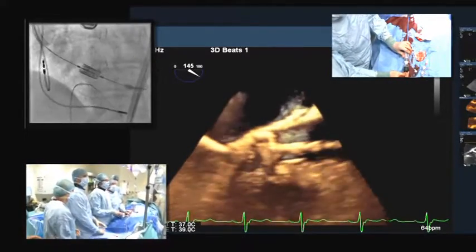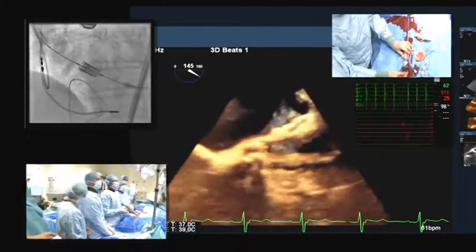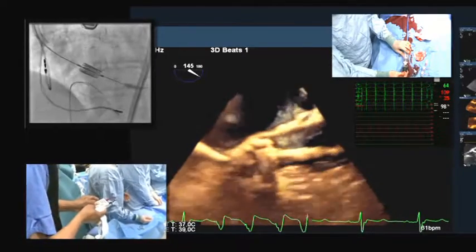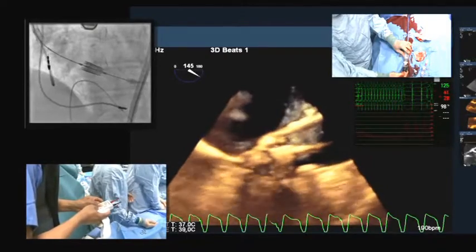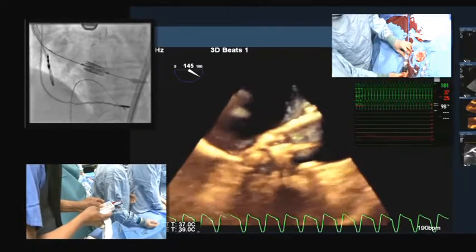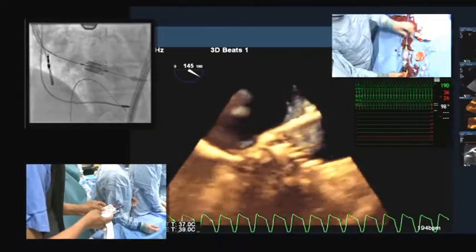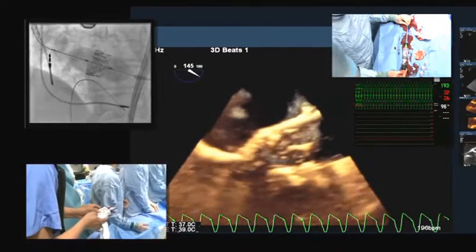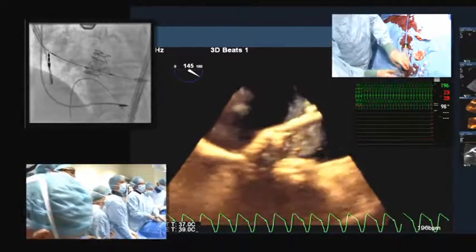Okay. Good. All right. So, Ragu, 180. Pacing on, please. 180. Pacing. Let that pressure come right down, John. Just move that valve down a little bit. Don't do anything. No. Don't inflate. Okay, John. Inflate now. Slowly. Up you go. Yeah, it's okay. Up you go, John. That is perfect. And balloon down. And pacing off. Thank you.